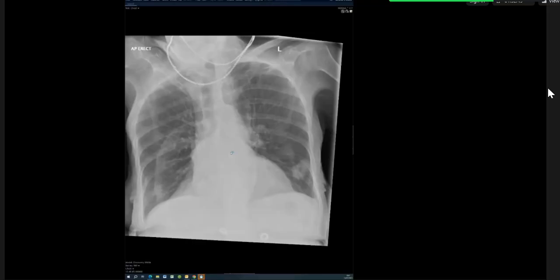And then you pause, and then they say something like fever, then it's infection. Then they say something like smoker, hemoptysis, and you say, given the history, I would be suspicious for malignancy. And if it's something this big, this sinister looking, if it's cancer, it is a very advanced cancer, so you can't just do a CT chest. You want the whole staging.